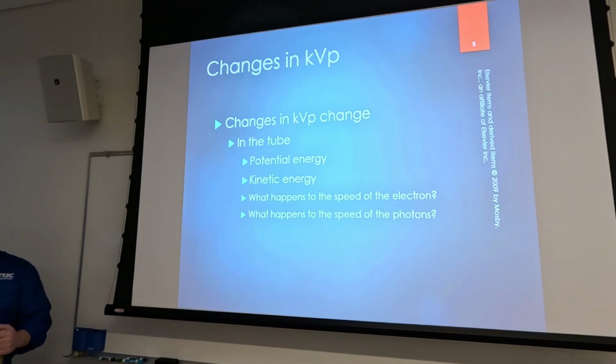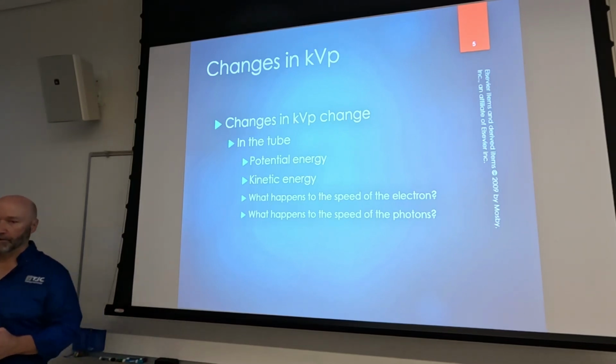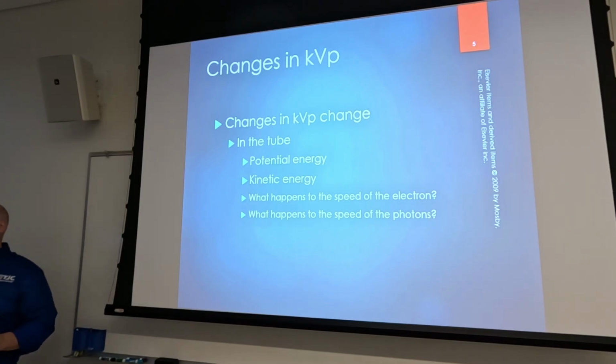There's a couple of videos, I think I've spliced them together on the YouTube page, that show exposure without the collimator housing on. I don't know if anybody's seen that. I'll try to find it and put it in Canvas. But it's just a spark. They go across the tube in the twinkling of an eye. It's not even a blink of an eye. Some websites will say approaching maybe a third to a half of the speed of light.